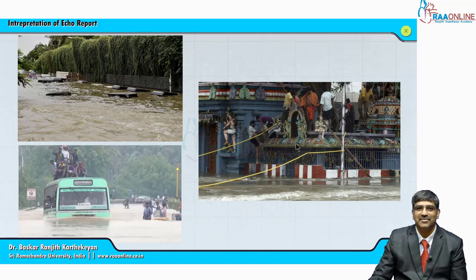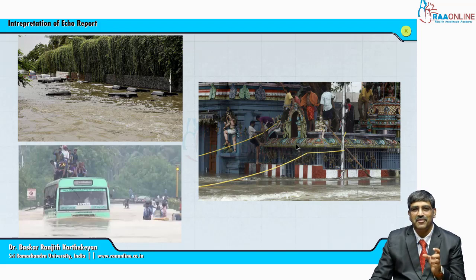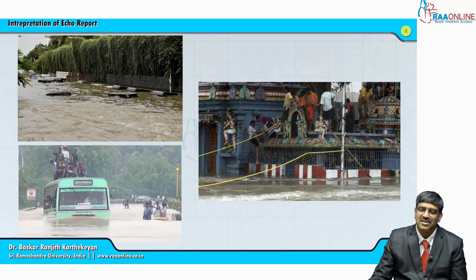By looking only at the ejection fraction, you are going to anesthetize. That means there is a danger waiting to happen. You have to understand each and every variable in the echo report before anesthetizing a case. It is not so difficult.